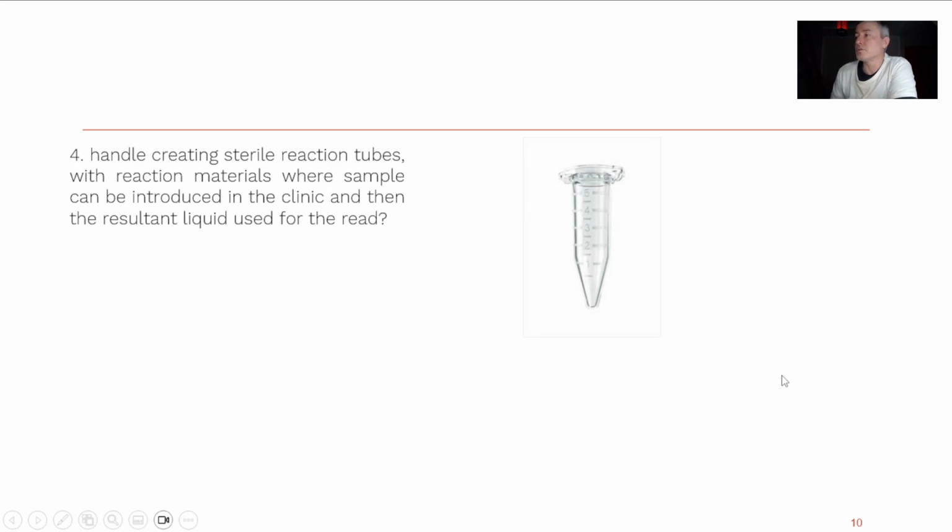One way that we have used this in the past is we've taken tubes like this and put lyophilized beads in the tubes. Somebody adds some sort of sample. There may be something like a LAMP assay going on, and if you heat a LAMP assay and you've got all the right primers and the target is in there, then often you can get hybridization going on, and you may get a pH change.